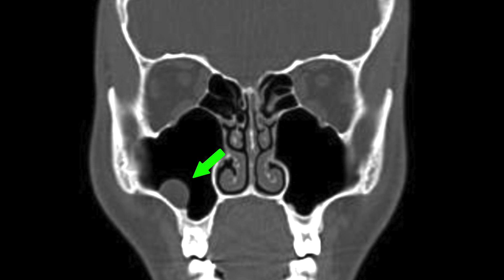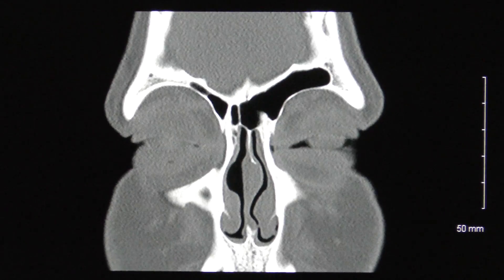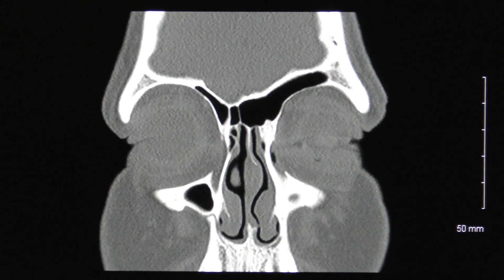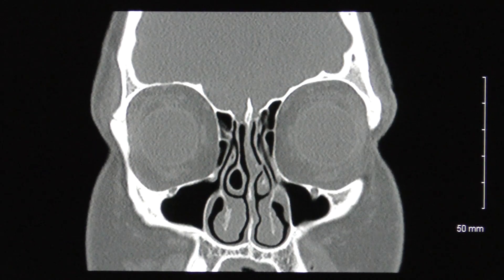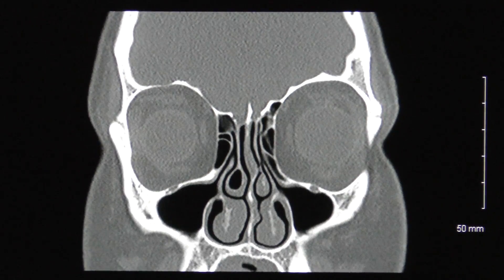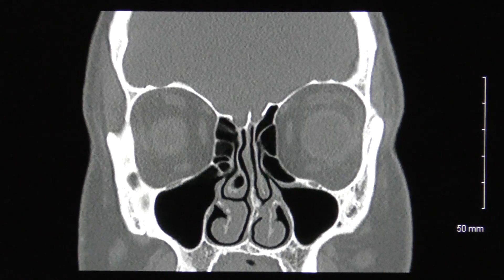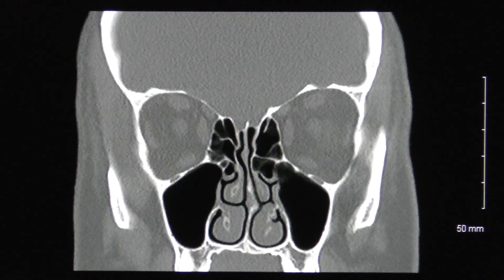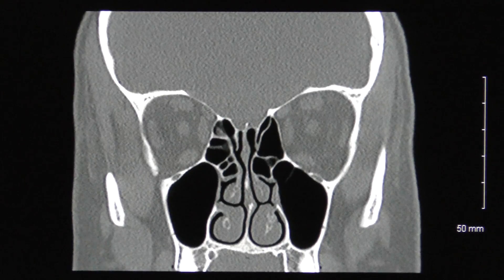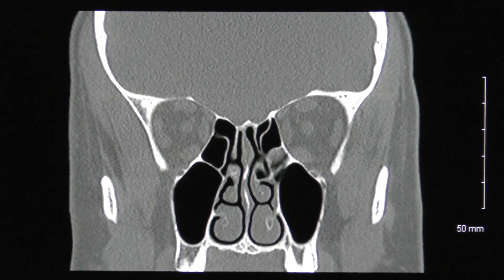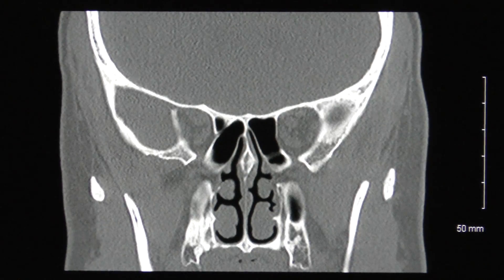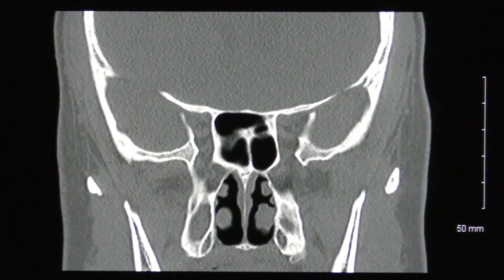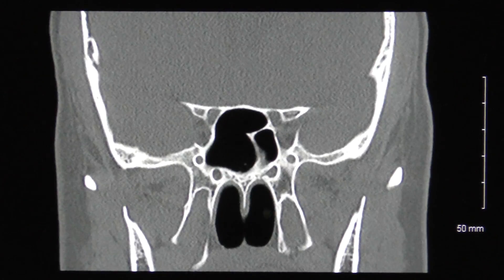Should a patient suffer from sinus discomfort but the CT scan looks normal, then the patient does not have a sinus infection or any type of sinus pathology causing facial pain and pressure. Rather, symptoms may be due to some other problem which may include allergies, migraines, facial neuralgia, dental pathology, TMJ, etc.